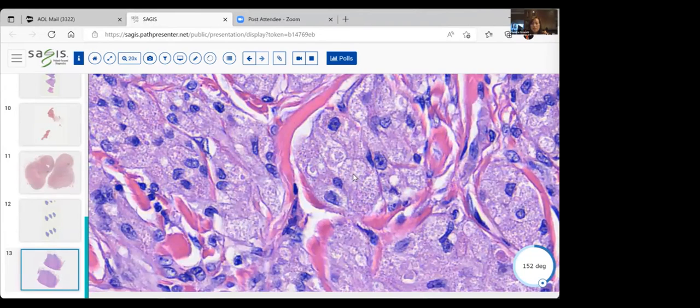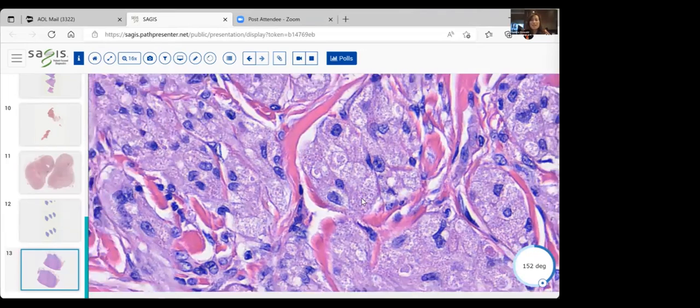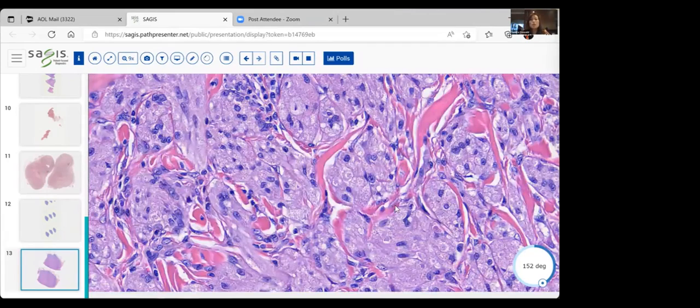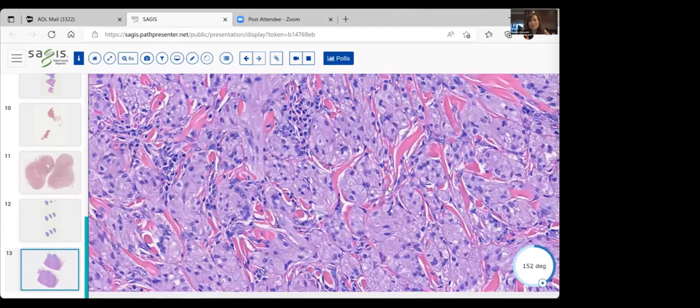But they believe this origin is unlike the origins that we were talking about earlier. They believe that these cells are derived from Schwann cells and are S100 positive. They're not sure, but that's what we believe, that these are neural tumors, again, a Schwann cell origin staying with S100. These were initially found on the tongue, and actually it is very commonly found on the tongue, but as we know, it can be found in other locations as well.